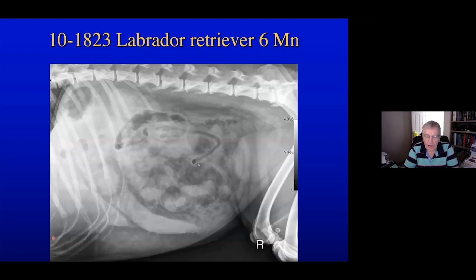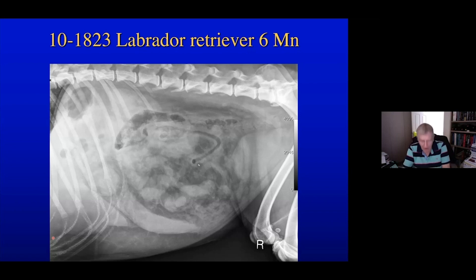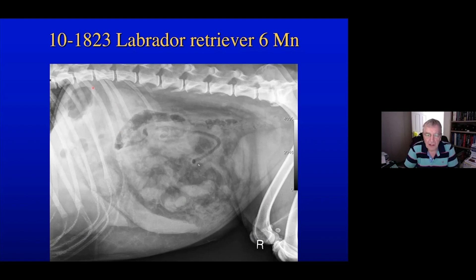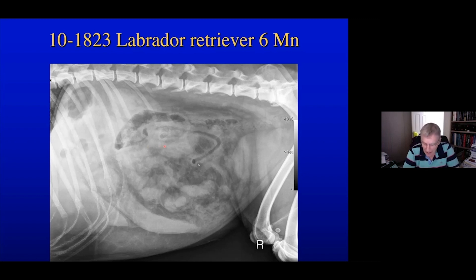I'm going to show you the radiographs from this dog. Here's the lateral — this is the right lateral. There are differences between the right and left lateral, not quite as marked as with the thorax, but particularly the position of the kidneys. The right kidney, which is always cranial to the left, will move further forwards under the weight of the abdominal contents.